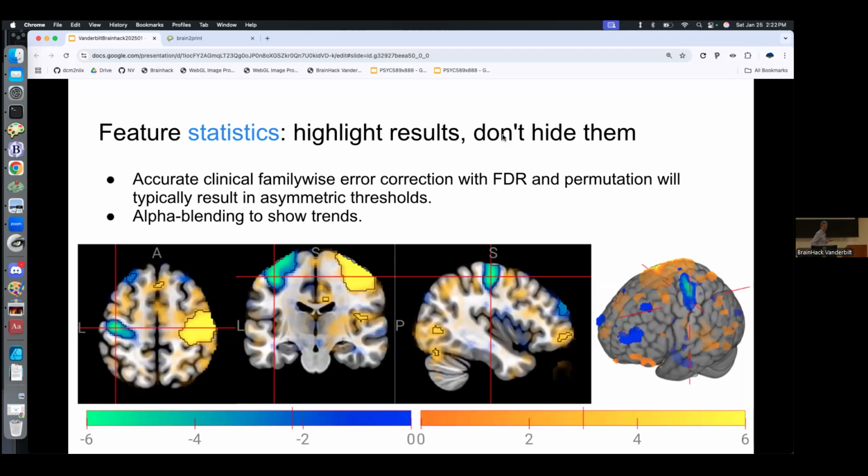There's other little things we thought of. And one thing, people talk a lot about the reproducibility of neuroimaging not being very good. And one of the challenges is because we tend to have to correct for so many thousands of comparisons, we tend to be very stringent on our statistical thresholds. And it ends up we just see the peaks of icebergs, and we don't see the trends underneath. And so one of the things we provided is the ability to outline and say, these areas that are outlined are the areas that survive the strict statistical thresholding, but you can also see the trends and see how similar the patterns are between other studies, that even though different peaks might be surviving in different studies, maybe the overall trends are the same.